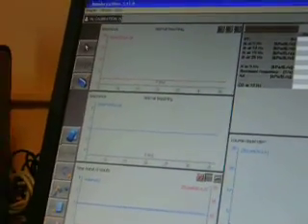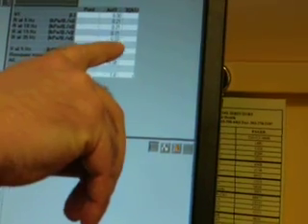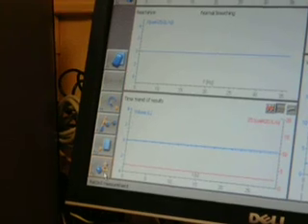You want to make sure that the value is within 10% of the reference unit. The reference unit is supposed to be 0.2 kilopascals. So all the measurements are 0.21 or 0.22, which is within 10%, so we are good. We then exit the system to save the measurement.